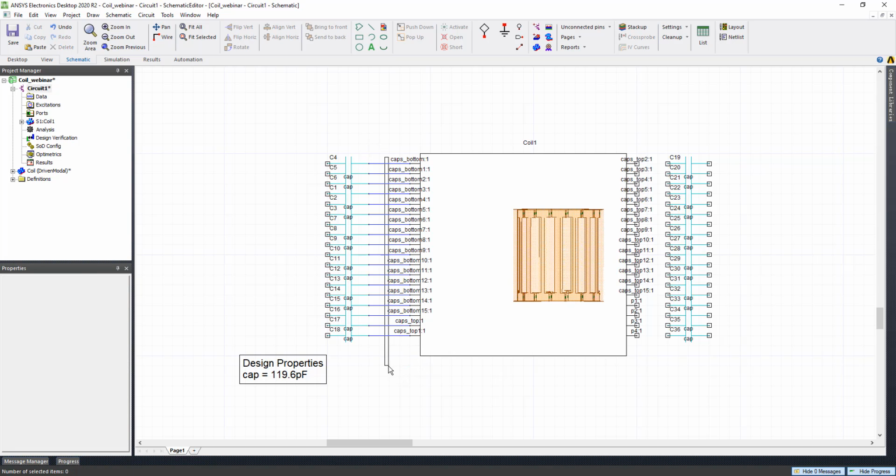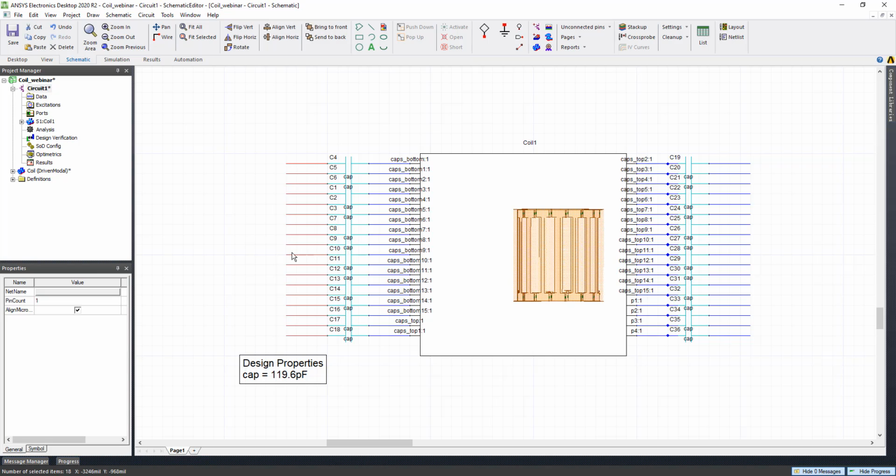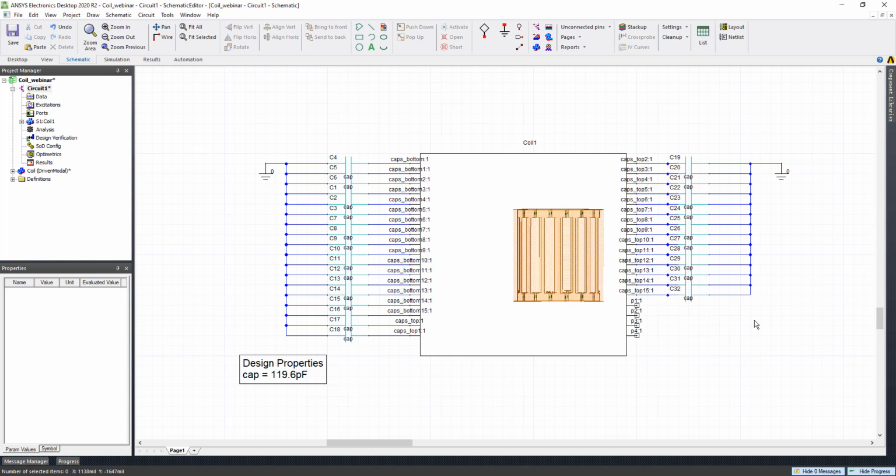Delete this too. Copy, paste, paste. I'm going to give them a ground. Right, they are all having the ground, and then just link it all up to the ground. Okay, now I have the model set up. Oh, sorry, I forgot. Here are the ports. So I shouldn't have the capacitor here. Copy too fast. Yep. So now I can just copy all of this. I'm going to give them a port, right? This, and this. Okay.